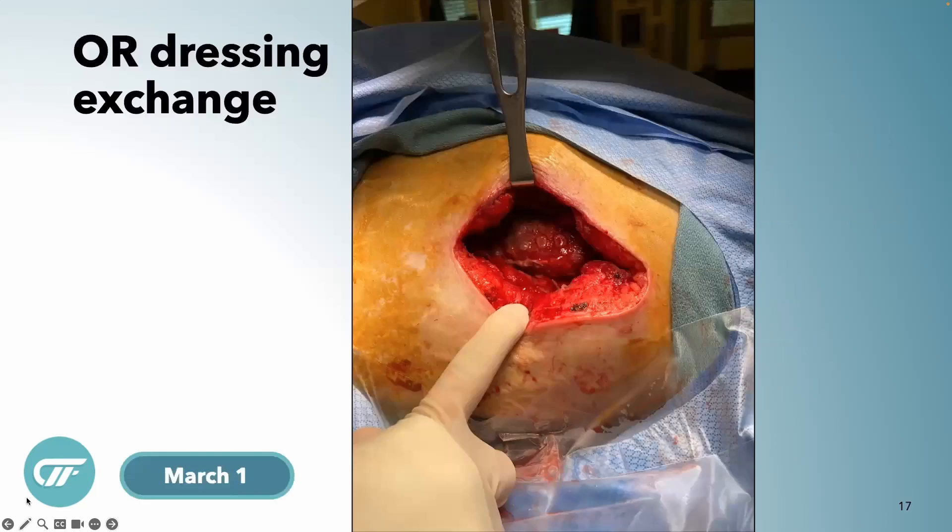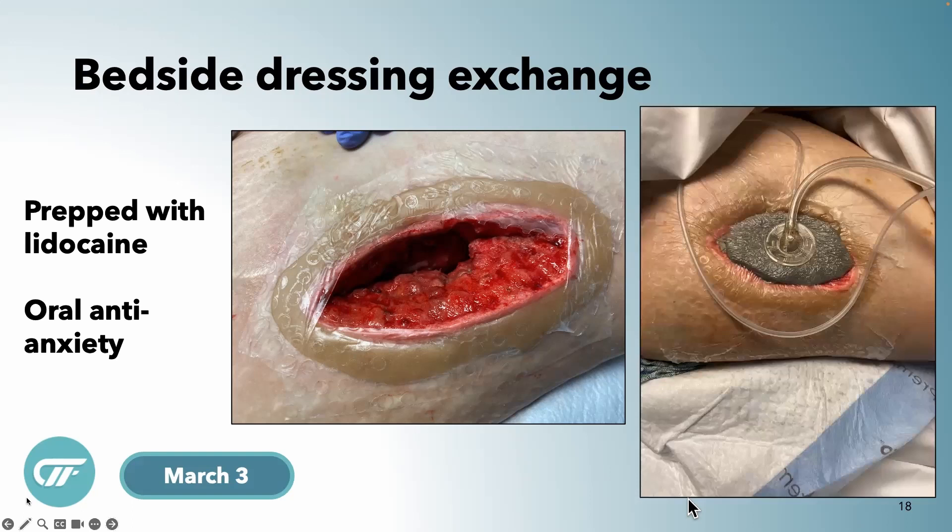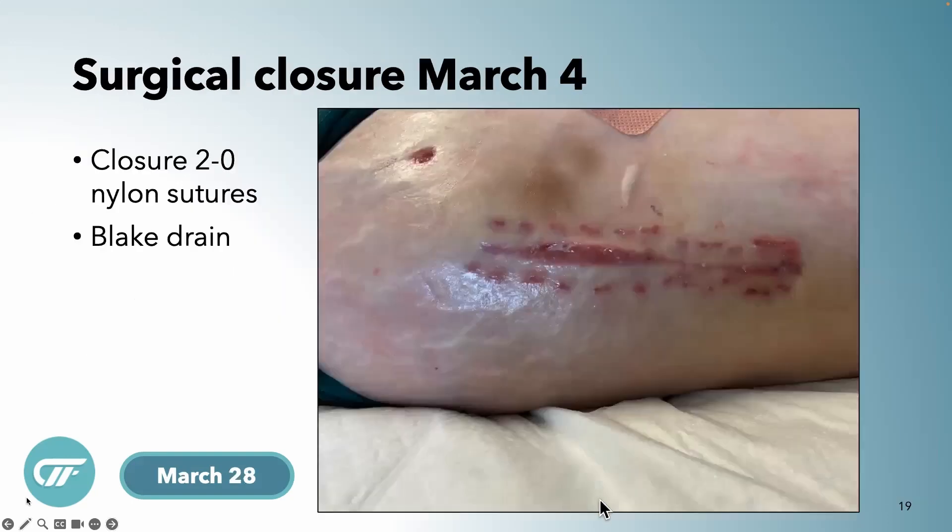After just one dressing change — we went back to the OR for this first one — it was clean as a whistle in there. The next one we did at the bedside. We prepped with lidocaine because we had to pull that big foam out, which isn't going to feel good. Using the instill port that was way under the skin, we instilled some lidocaine on the edges and underneath, and she did great. I'm still putting a barrier ring around all my instills and draping as well, just to make sure there's no leaking during the instill phase.